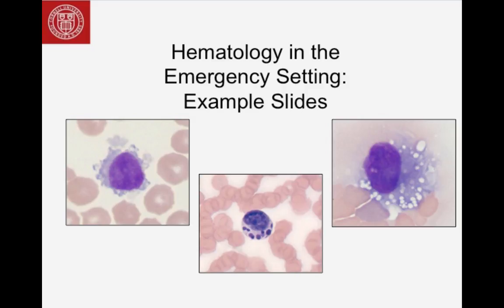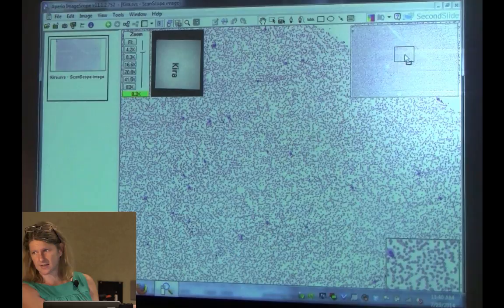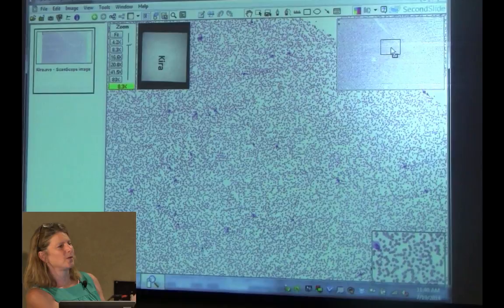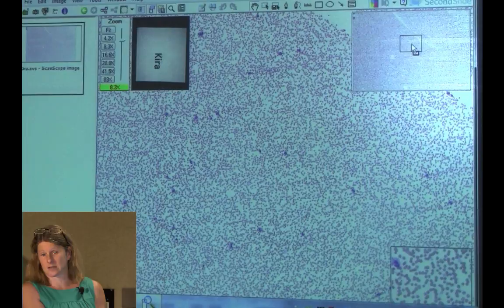Looking at this case at 10x: there are quite a few white cells here — for a cat this is probably mildly increased, not 50 or 60,000, but mildly elevated. There's a little more white space than I'd like, so I wonder if the animal's mildly anemic. When I look at a blood smear I look at it blinded — I don't look at the counts first, I make all my assessments, then check if everything matches. That way you don't focus on one thing and miss another.